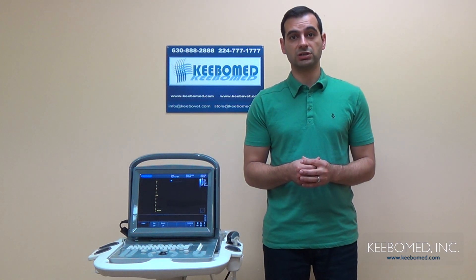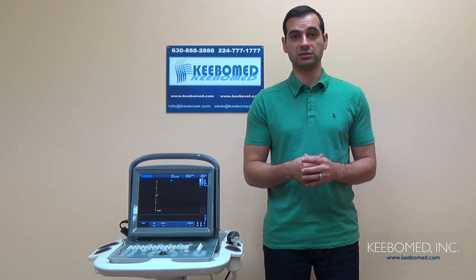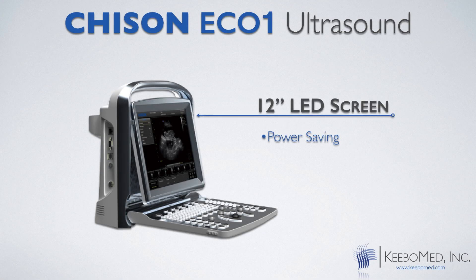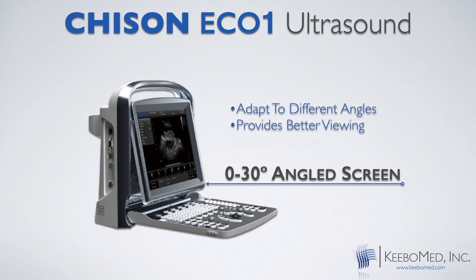As you can see, the screen is very large. It is 12 inches, and it is also a high-resolution LED. An LED is very advantageous over many of the other models that feature either LCD or CRT. An LED is power saving and it produces a better image quality because of the higher resolution. Also, a unique feature of this model is that it has an adjustable screen that can be adjusted from 0 to 30 degrees, allowing an easy ability to view the screen no matter which angle you are at.